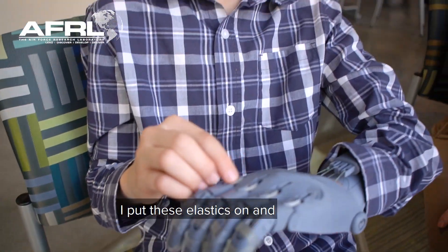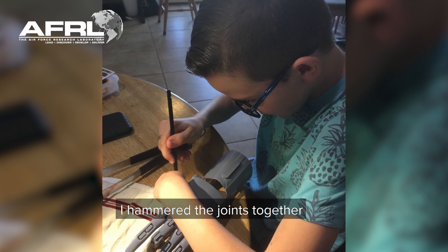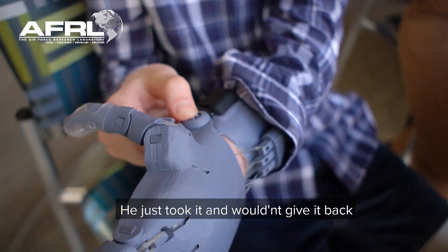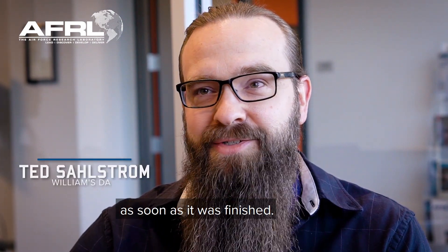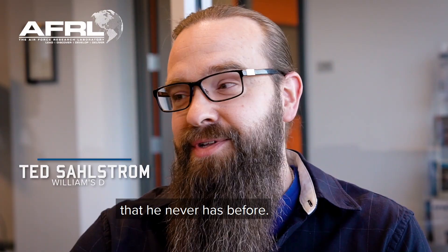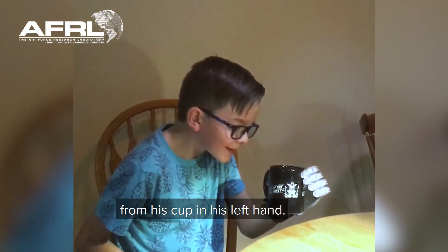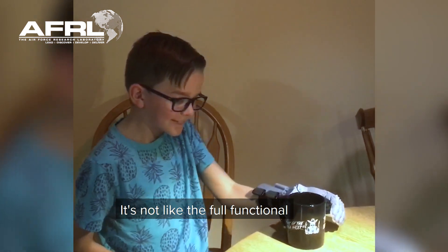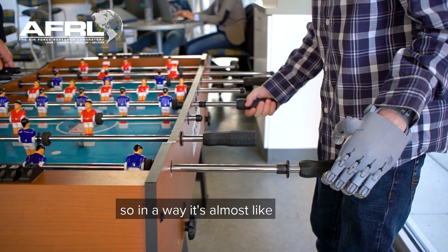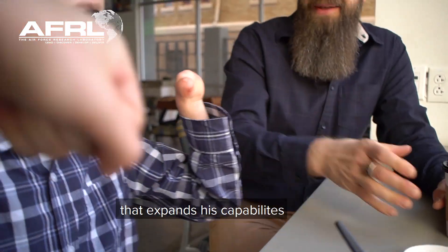I put these elastics on and hammered the joints together, and I put these on. He just took it and wouldn't give it back as soon as it was finished. He's actually been able to pick up things that he never has before. He drank for the first time from his cup in his left hand. It's not like a full functional prosthetic, like a medical grade, but he has the grasping capability. In a way it's almost like a new tool that expands his capabilities.